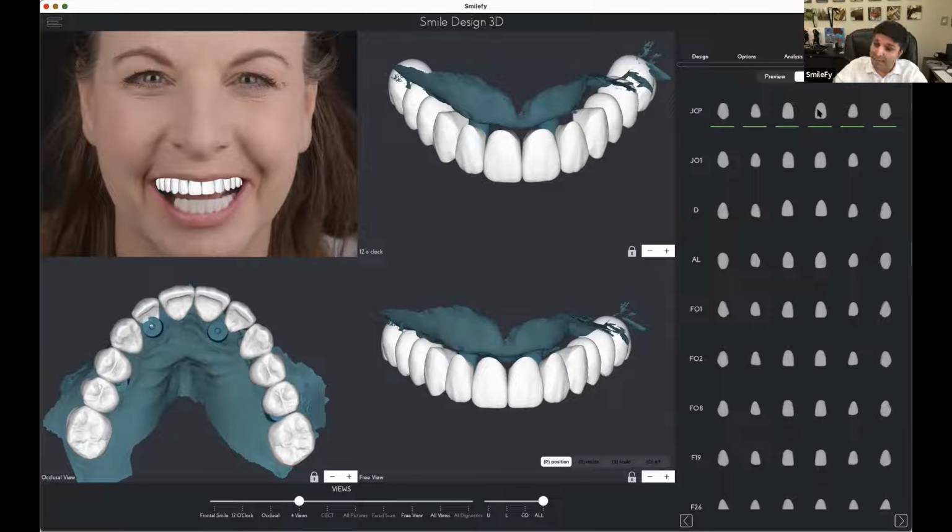Yes, everything is on Mac, on iPad. It's gonna be available also on the iPhone, but I think the display, of course, is very, very small. So you're gonna be more analyzing the project, right? But you can do it on the iPad and on the Mac. So mixed templates are also a very, very important aspect of our Smile.